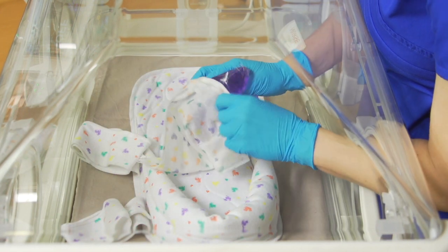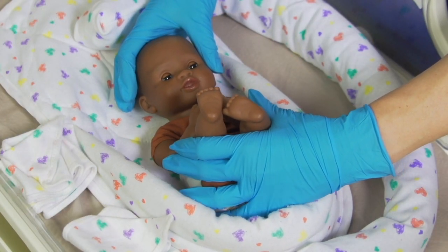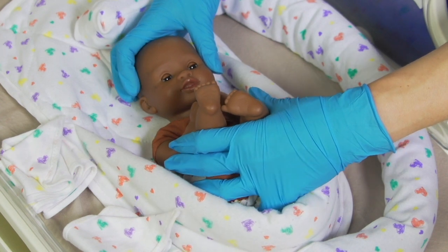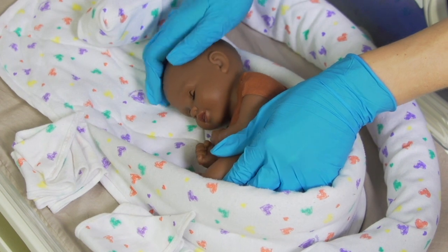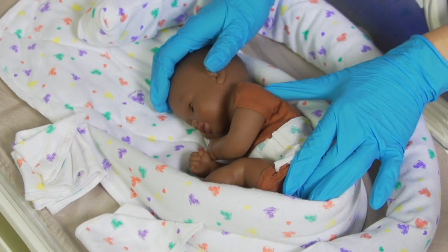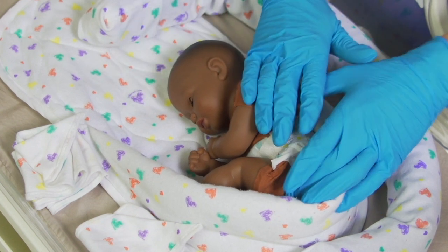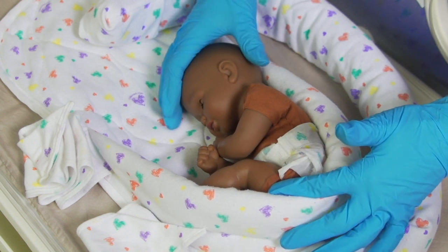Cover the gel with disposable cover before patient use. While maintaining a flexed position using hand containment, place the infant on their side, providing support to the head while aligning the shoulder and hip. This alignment is key. Flex the infant's legs and hips deep into the pocket of the Snuggle Up, keeping feet, legs, and hips well aligned. In this way, the Snuggle Up mimics the uterine wall.